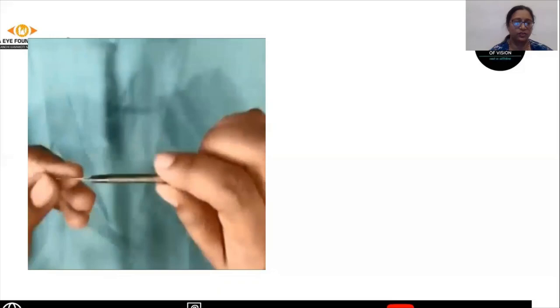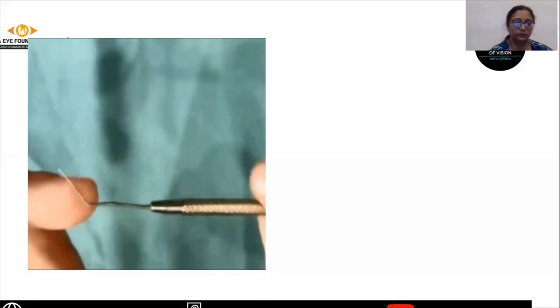The Vannas scissors are used to cut the iris. The next step is to push the prolapsing iris back into the anterior chamber, for which we use an iris repositor.